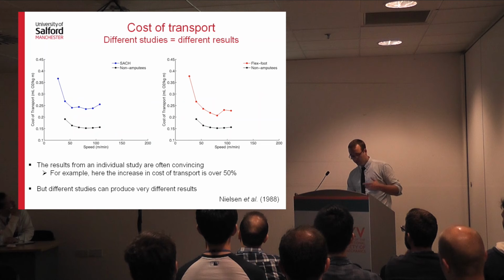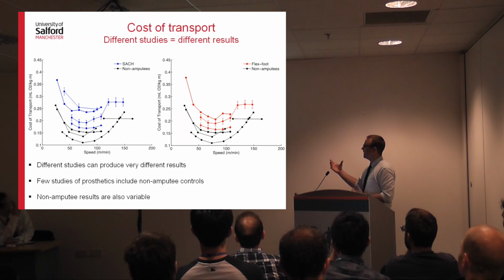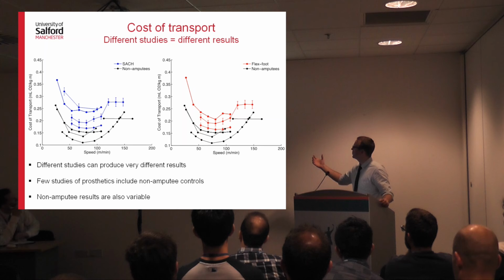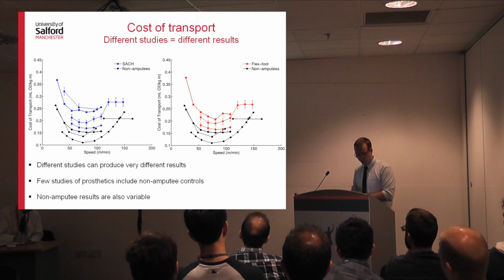But if I add in some data from some other studies, then what you start to get is a very messy picture. So on the left, we still have just SACH data and non-amputee data. On the right, we have flex foot data and non-amputee data. And as you can see, it gets very difficult to start drawing conclusions about what's going on here. Different studies are producing very different results.